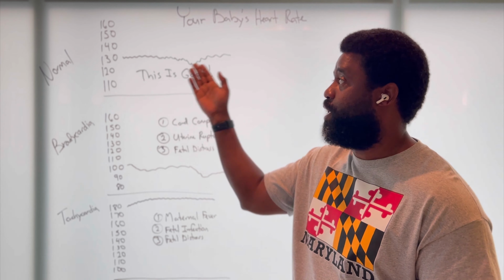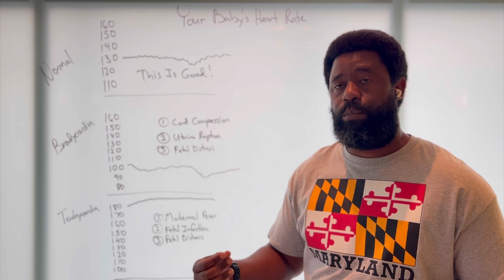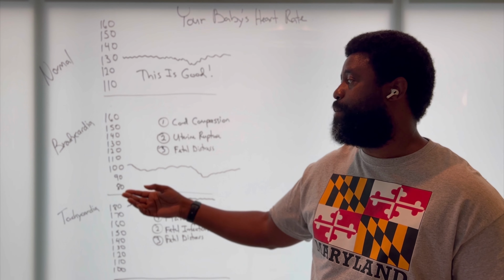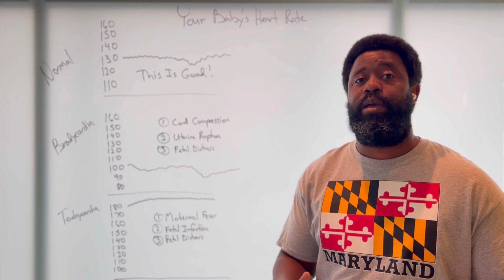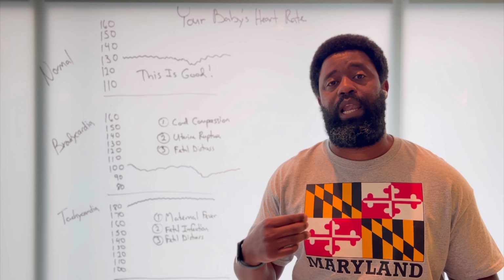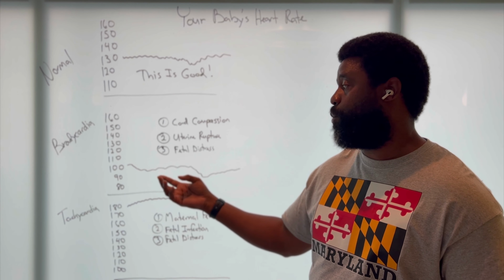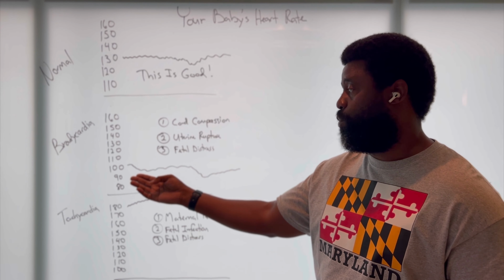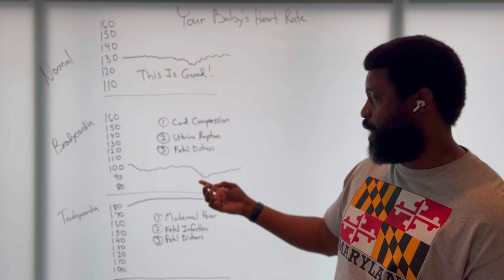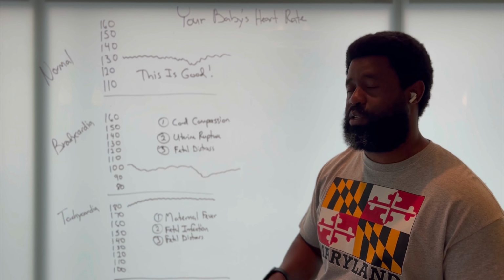The second pattern that we will see is called fetal bradycardia. Fetal bradycardia occurs when the baby's heart rate is below 110 beats per minute, and it can be very problematic if it is allowed to go on for too long. On the board, you can see the baby's heart rate as it's being charted on the electronic fetal heart monitor. It's in the 100s, dipping down into the 90s or maybe high 80s, and then going back up. This is an example of fetal bradycardia.